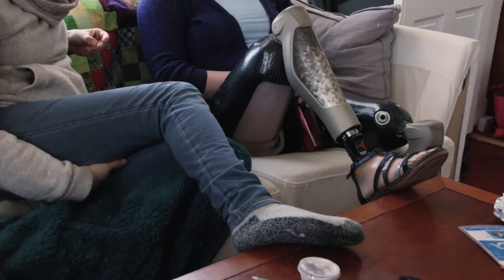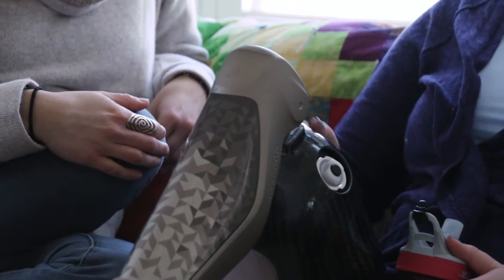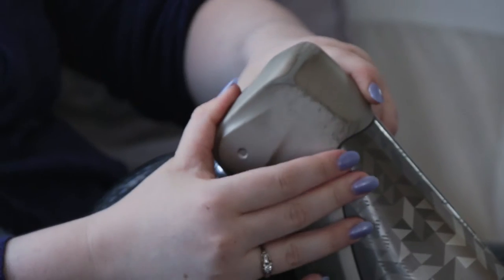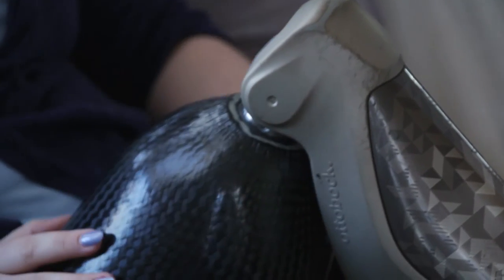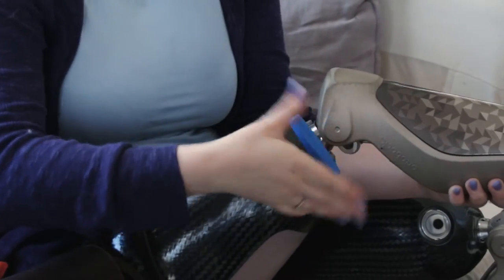Is it adaptable so that you can attach any prosthetic onto it? I don't really know how the adapters work, but this little piece right here — you could call this an adapter — because you can unscrew it, you can take it off of the socket, you can take it off of the knee, and the knee could be attached to anything else pretty much. They're loctited very well.